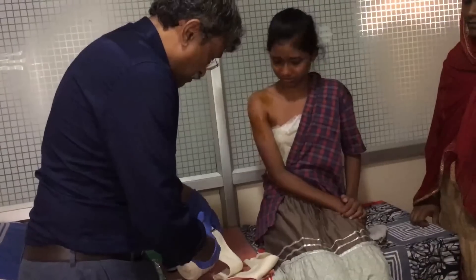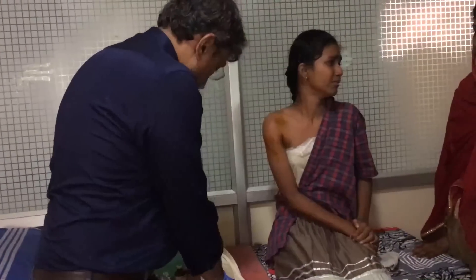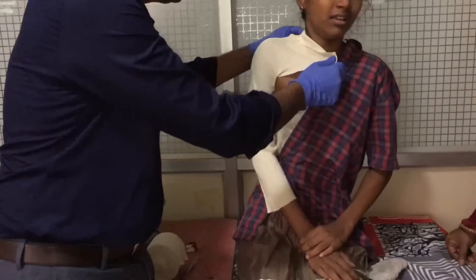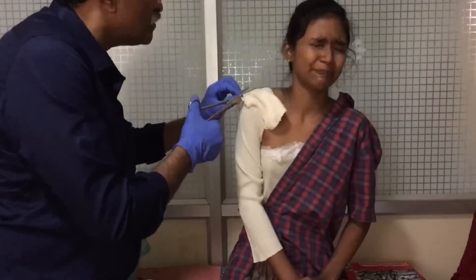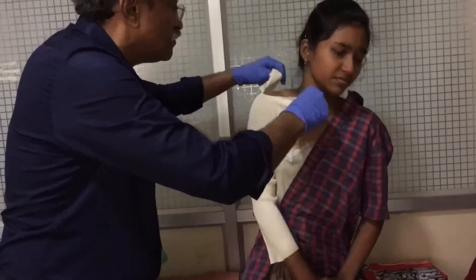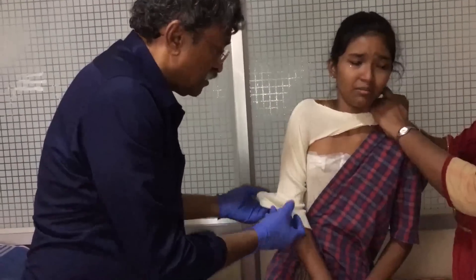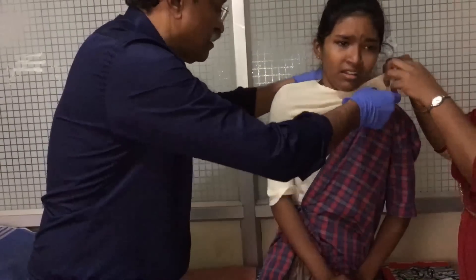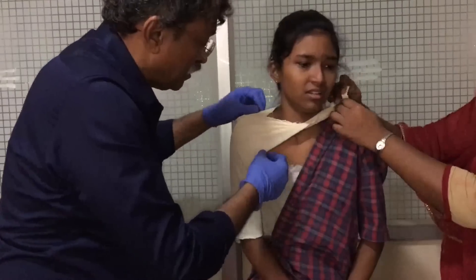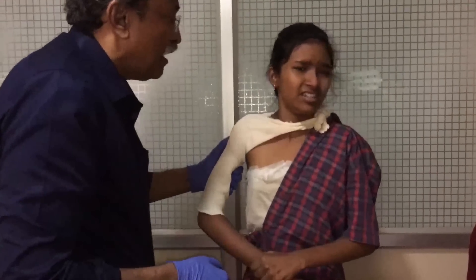A piece of stockinette is cut and wrapped around the arm, slitting proximally. This is then tied like a necklace around the neck — a new trick being taught in this video. An arm gaiter, or humerus cast brace, in a single layer of ultralight cast is going to be applied.